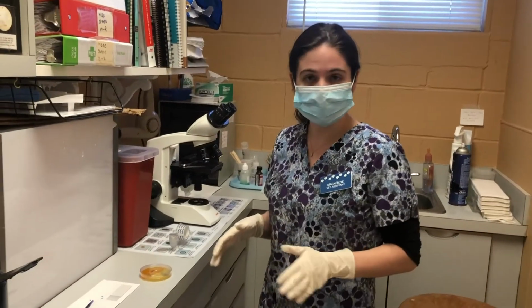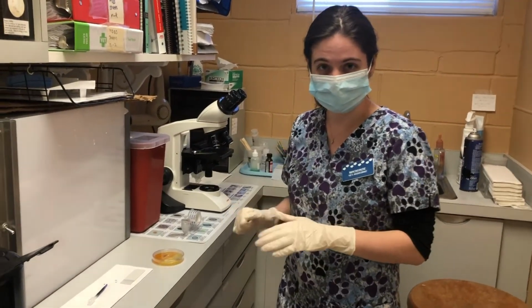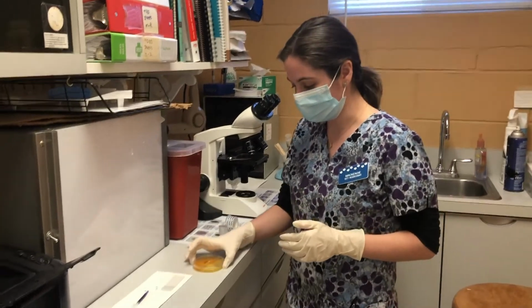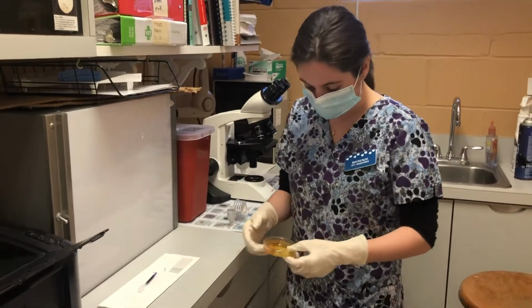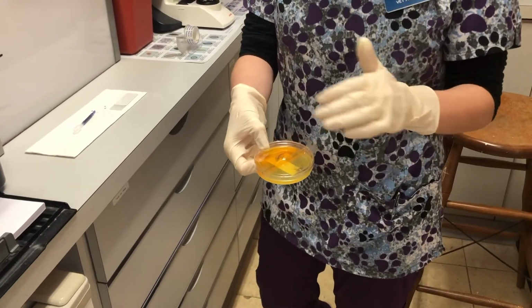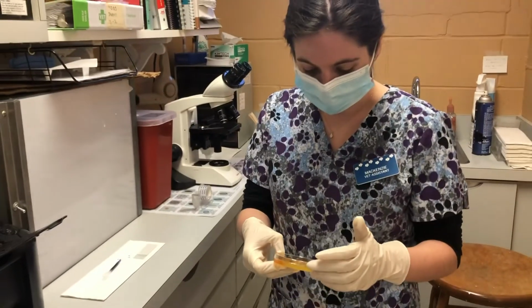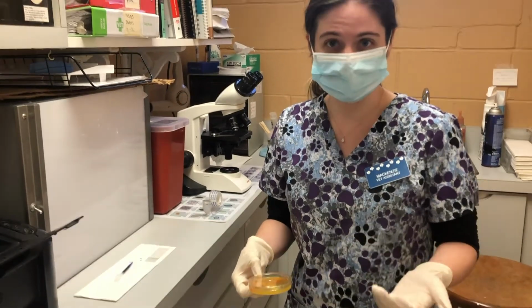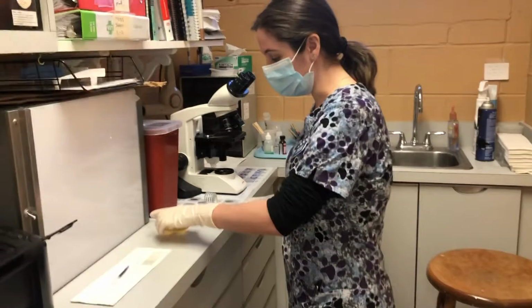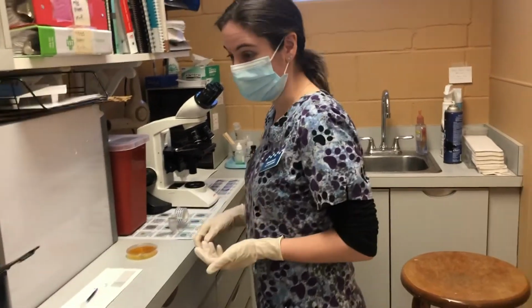So it's been a few days since I set my culture plate to the side to let it incubate. So now we're going to take a look, see if we have any growth or color change. And right off the bat, it doesn't look like, at least visually, that there is any growth. So at least visually, I would consider this a negative sample. We're still going to look at it microscopically to make sure we don't see any dermatophyte spores.